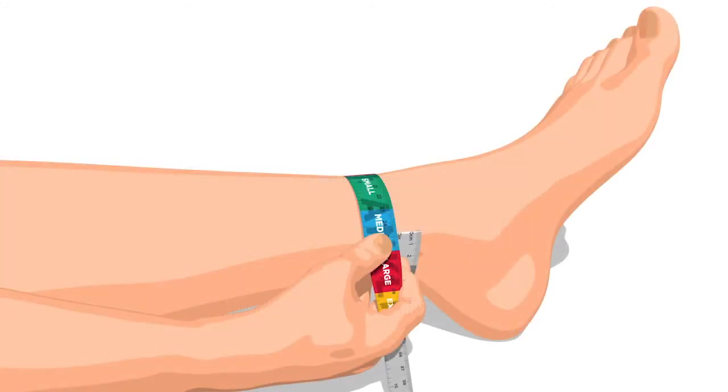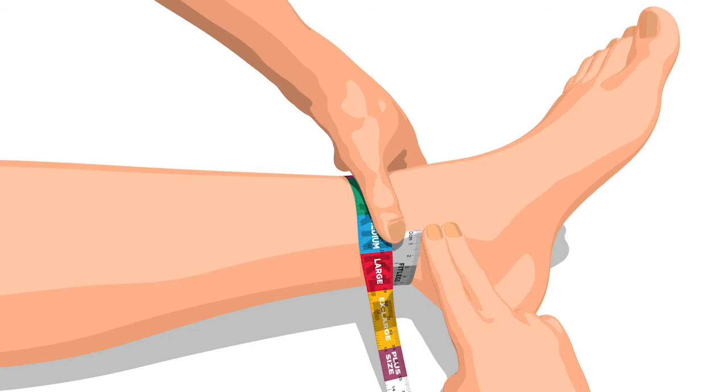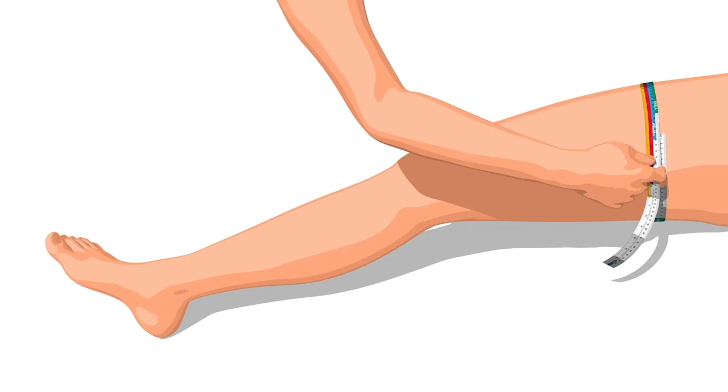To measure for a thigh-length anti-embolism stocking, start by measuring the ankle 2 finger widths above the ankle bone to determine the correct size. Next, measure around the widest part of the thigh. The second measurement is a safety check to ensure that the patient is suitable for a thigh-length stocking. If the patient's thigh size falls outside the colored sizing band, consider using below-knee stockings.